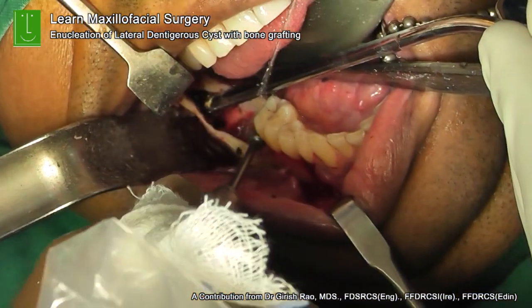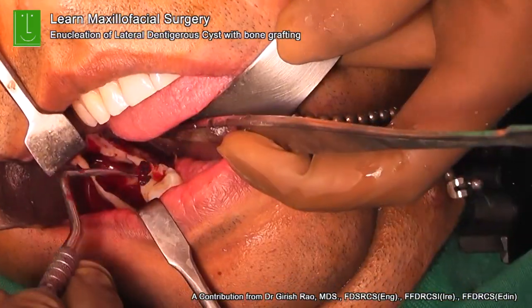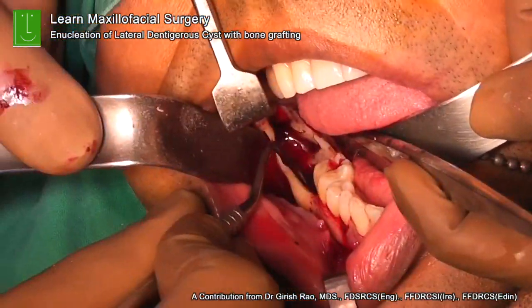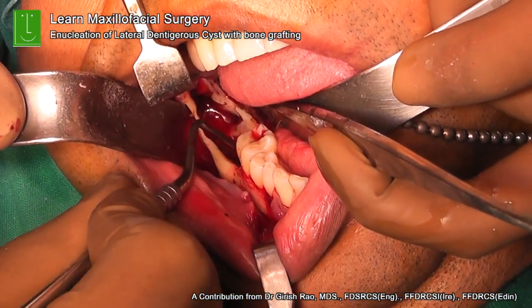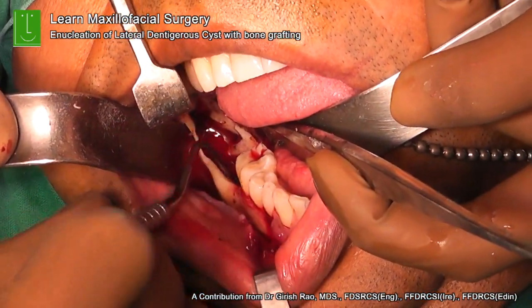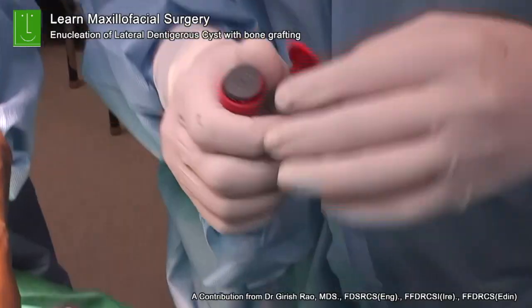And whatever fixative has been done, the chemicals which fix the tissues, that is all cleanly curetted out, either with a curette or with a burr. So now you can see the bleeding, and that indicates that the cavity is again completely, thoroughly enucleated. These simple steps will help in basically prevention of a recurrence.